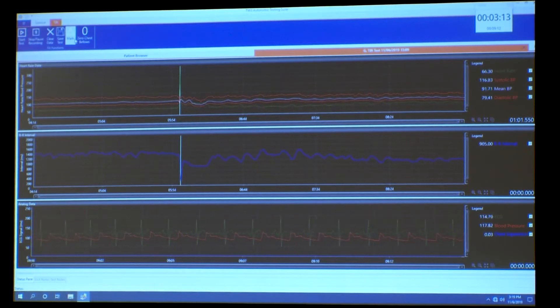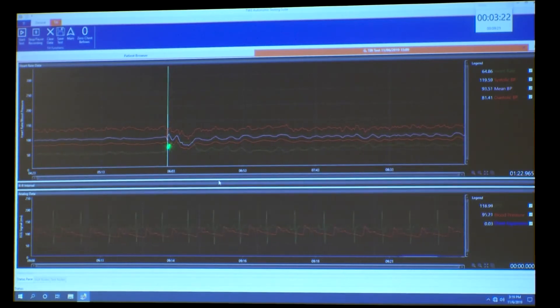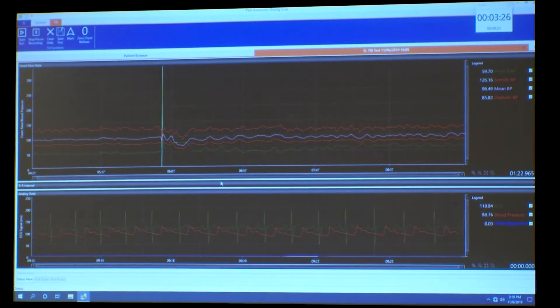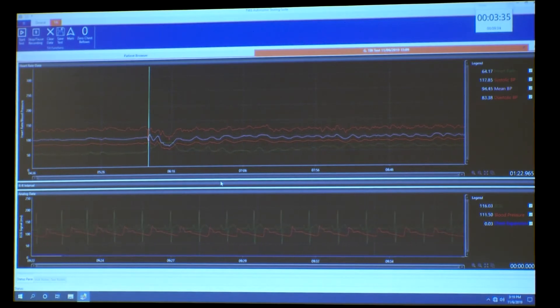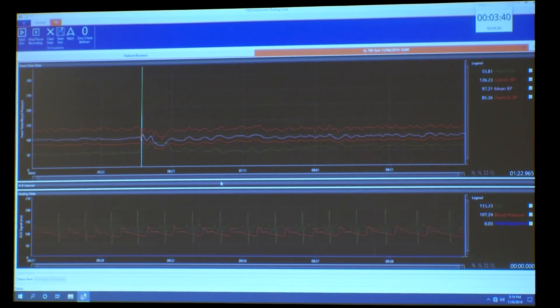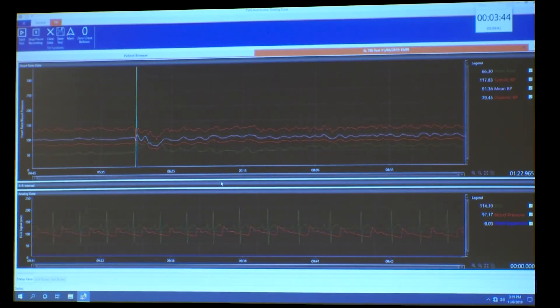Something worth pointing out: right after he stood up there's a transient blood pressure drop with associated tachycardia. That is really something you only see — or predominantly see — with active standing. This is the key difference between head-up tilt and active standing: it's the first half minute. After that they're pretty much the same, but the initial drop is much more pronounced when someone actively stands up.